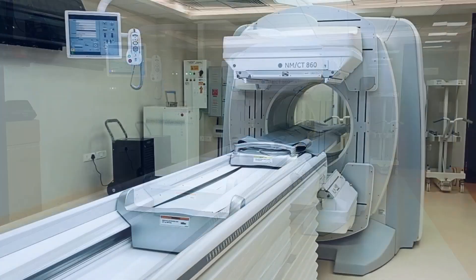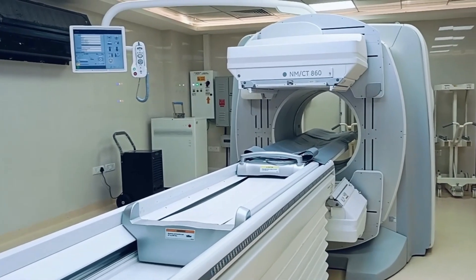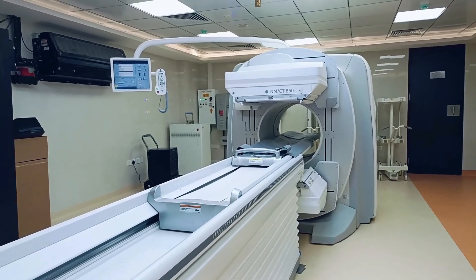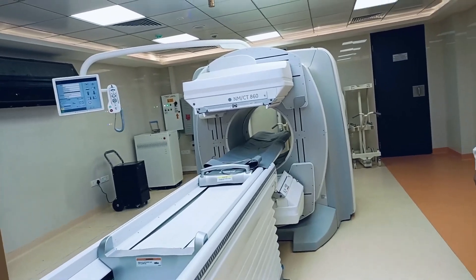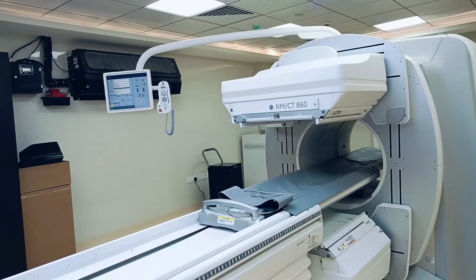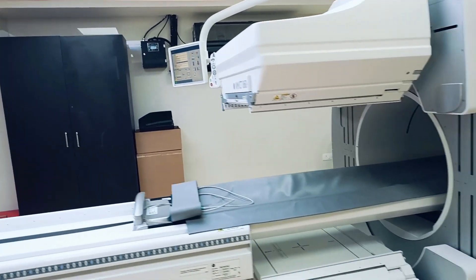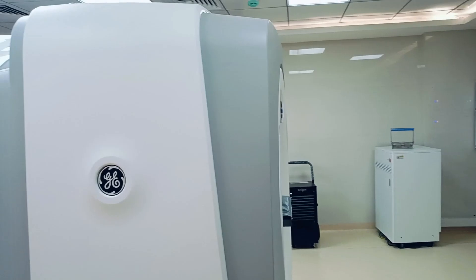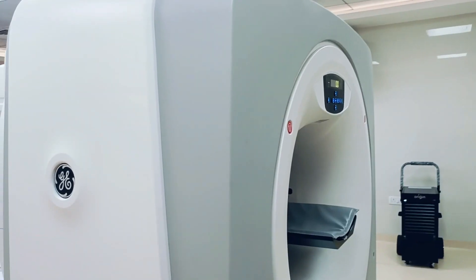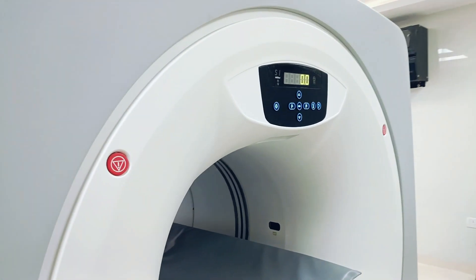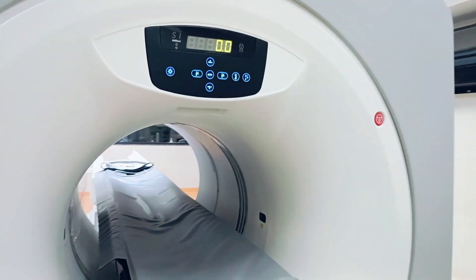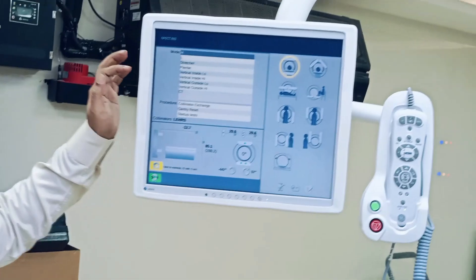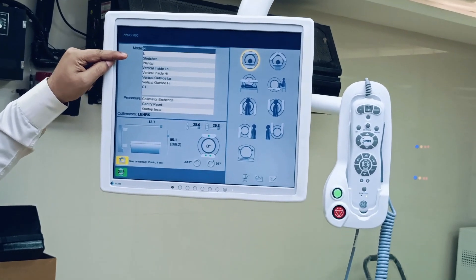This is the NMCT 860 machine. It has a SPECT system with dual head and 16-slice CT. Today I am going to show you the different detector modes available with this system. On this interactive screen, you can see different gantry modes available.